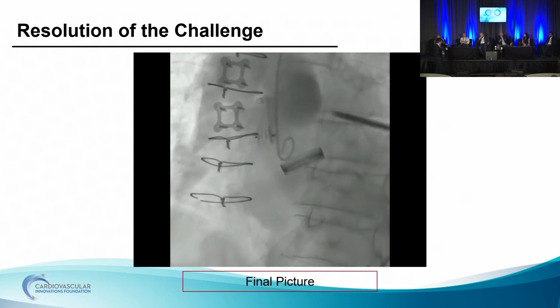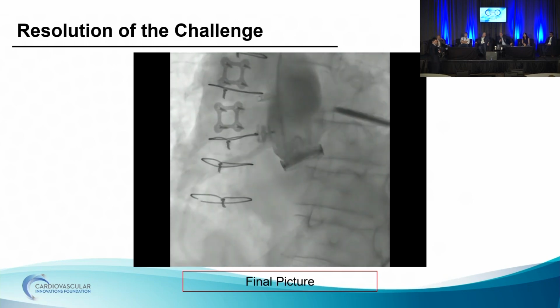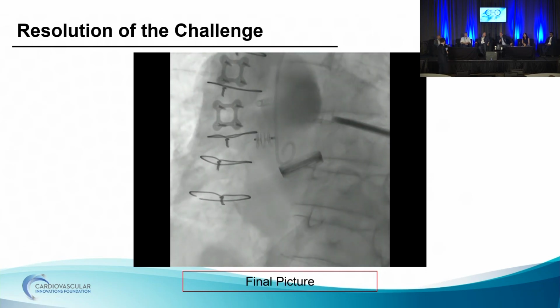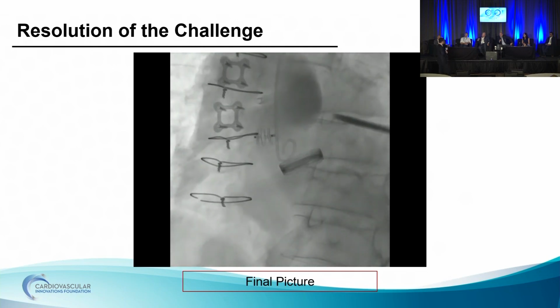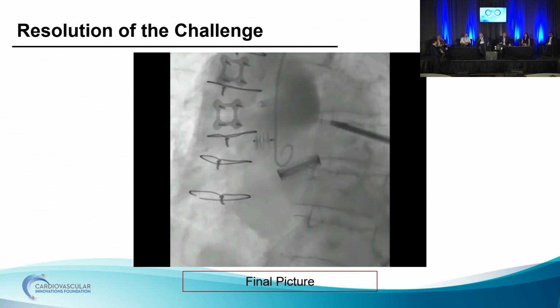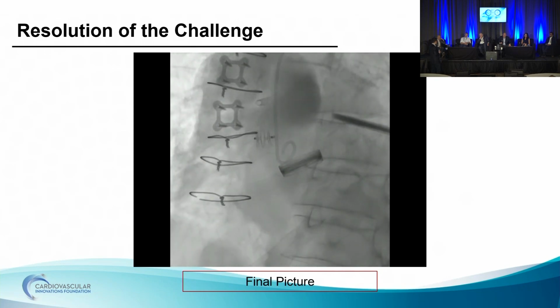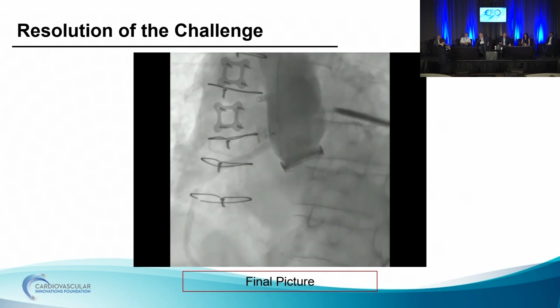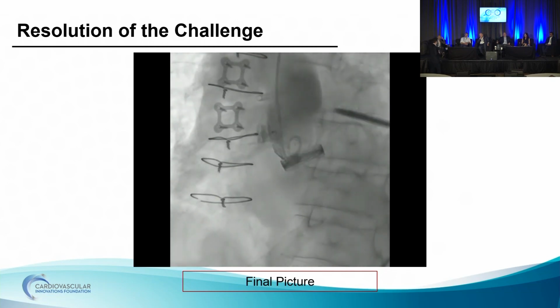So you decided to fully deploy that device before putting the stent. Why'd you do that? We went a lot back and forth: should we just deploy the device and then crush it if needed with a covered stent, or should we still attach to it and deploy the stent afterwards? The reason we decided to go that way is that once the PK Papyrus is deployed, there's no way we're getting the plug out. Even attempting to take it out, it would be D-shaped under your covered stent with the snorkeling. So we felt that whatever it is, it's going to be jailed underneath. We want to make sure we have good coverage.